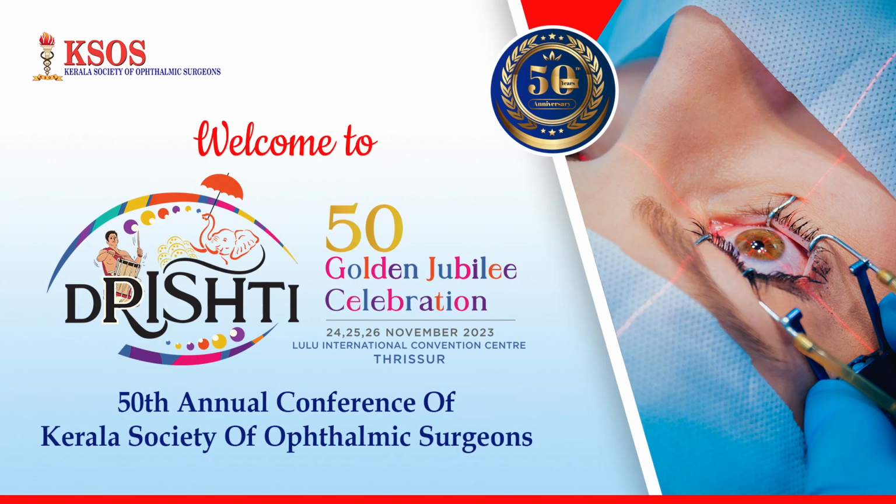Not just an anterior vitrectomy, but a complete pars plana vitrectomy. No PVD induction. 360 degrees of endolaser is also done. The periphery is checked properly, and only then is the IOL inserted.